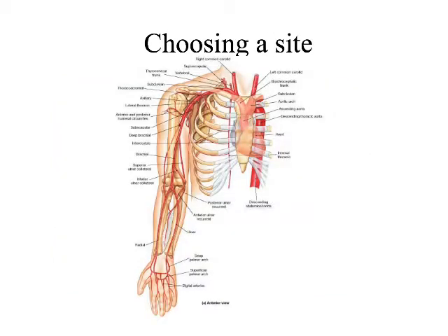And thinking about sites, if we're talking about mechanical injection, and that means using a robot to inject IV contrast into a patient. We do that in CT. That's a big part of how CT works. We use these intelligent mechanisms that can sense people's blood pressure to do the injection for us. And it's like they do the timing and everything. When we're thinking about that, we have to be very careful, right?